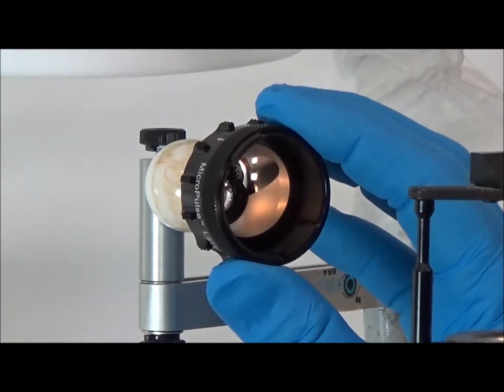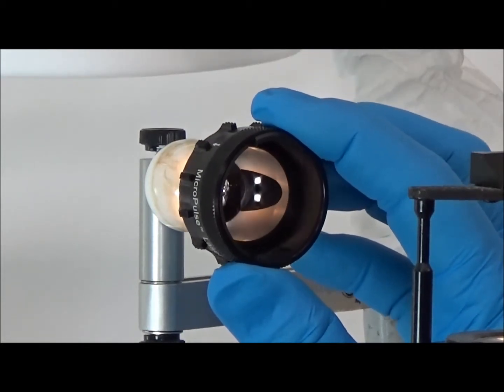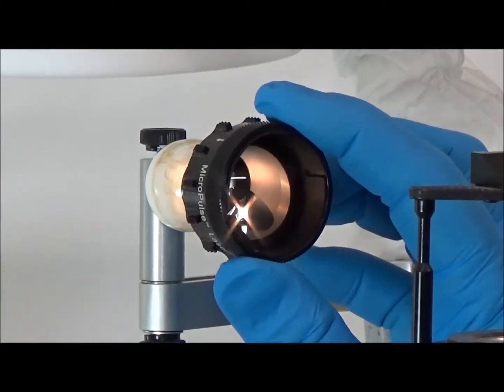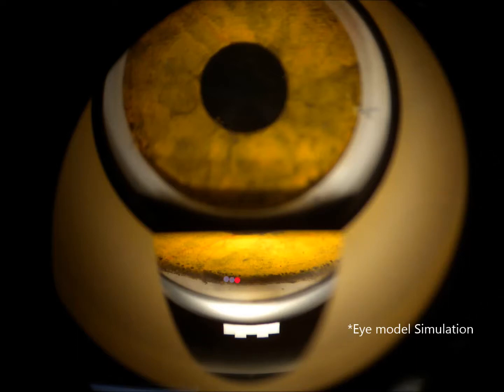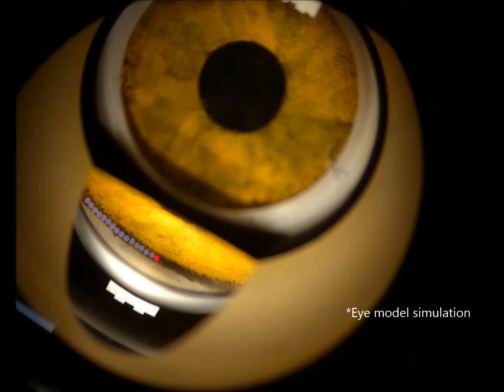Once the lens is rotated past the magnetic engagement, the rotation is free and smooth until the next indexing position is reached. This demonstration shows the reference figure being used as a guide for placement of micropulse laser spots. Precise angular rotation of the contact lens ensures consecutive alignment of each series of 10 laser spots.